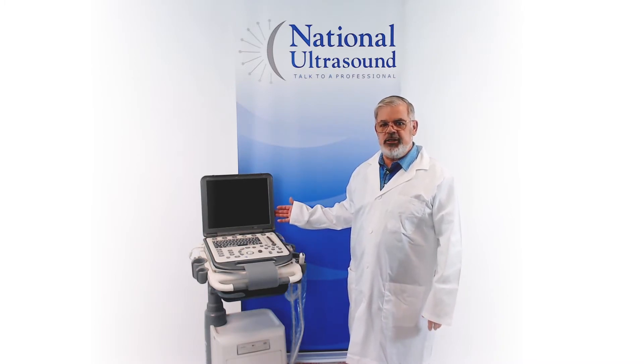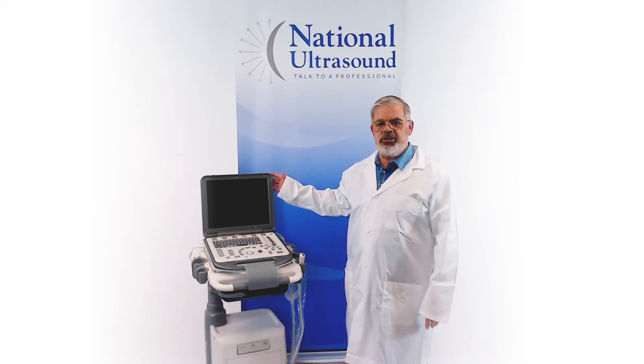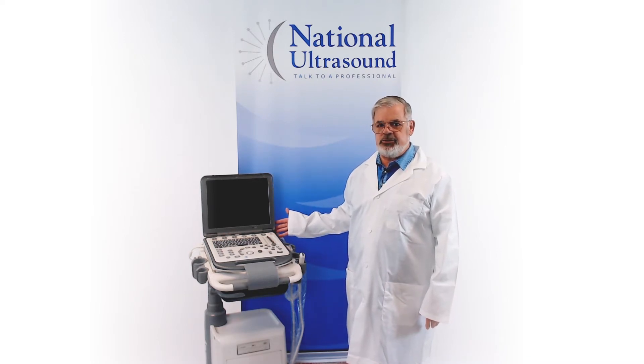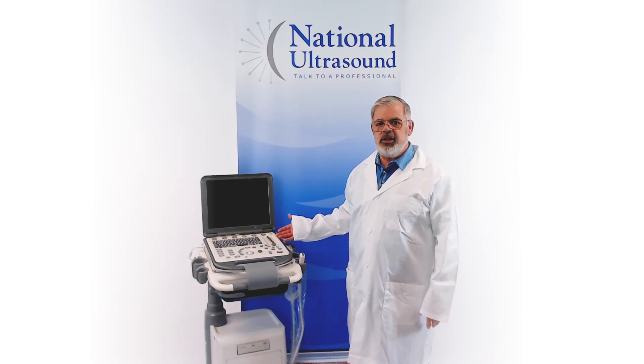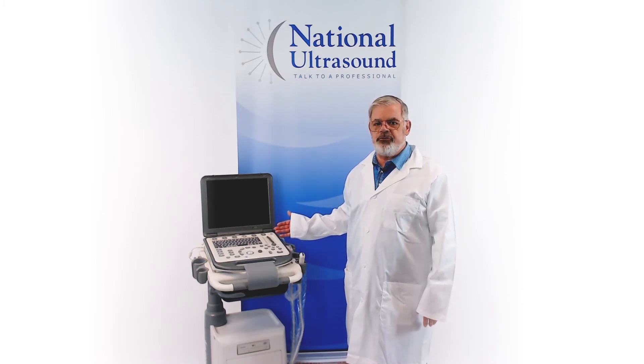The Mindray M6VET is a portable ultrasound machine that has many amazing features. The large 15-inch screen and eight programmable buttons allow for easy operation. It's portable and compact enough to travel from room to room or farm to farm.